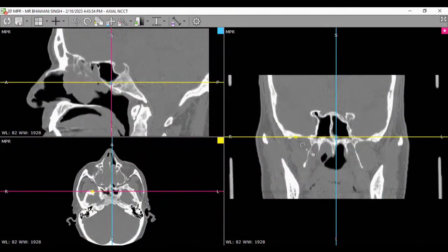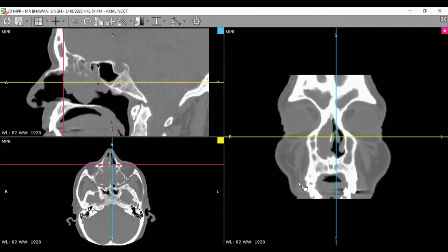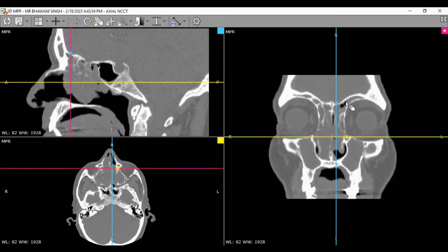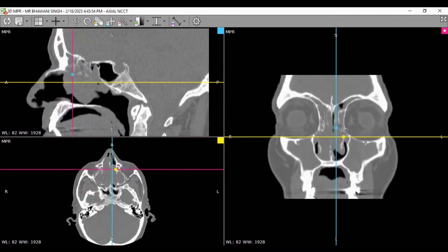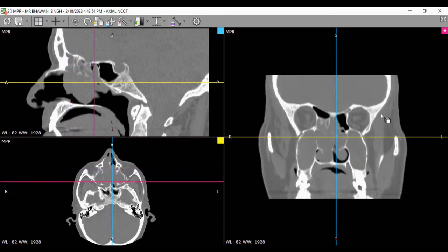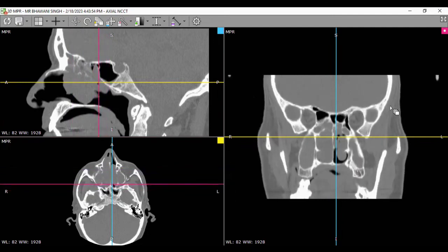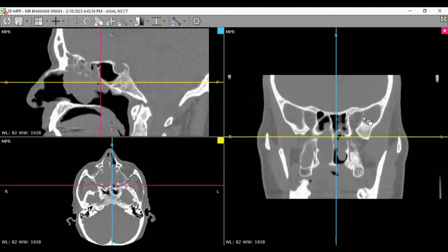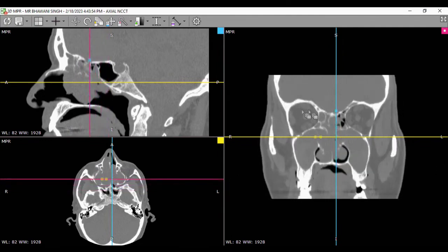Yes, that is the CT scan of the same patient who was just operated on. Just forgot to show you before. So that's a classical one. We saw the agger nasi, this one, and the maxillary, regular one. Sphenoid, see, the regular one with little mucosal edema, but nothing significant. Most of it is opacity because of the polyposis.